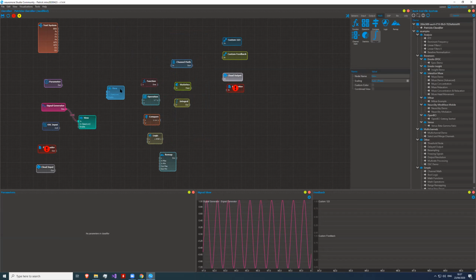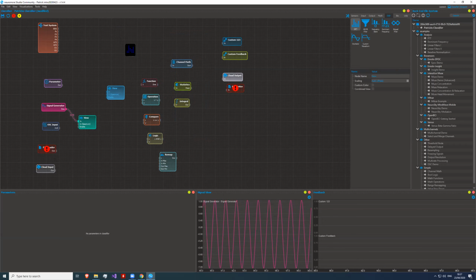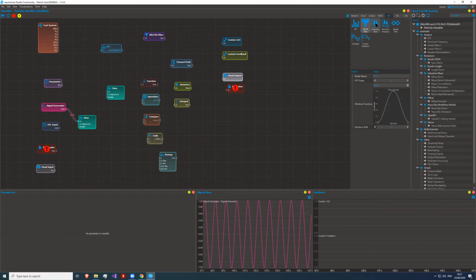And if we now come down to where things get really interesting, if we talk about biodata or EEG, there are things like an FFT, a fast Fourier transformation, some filtering, and you can extract frequency bands.